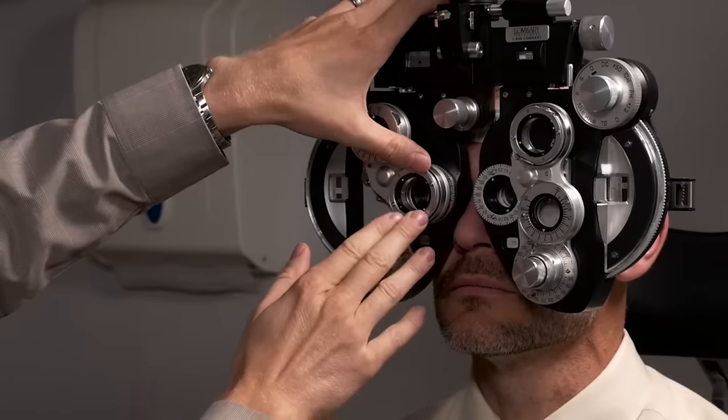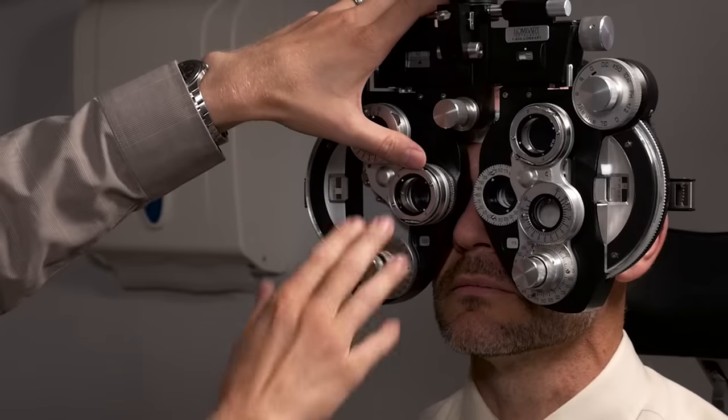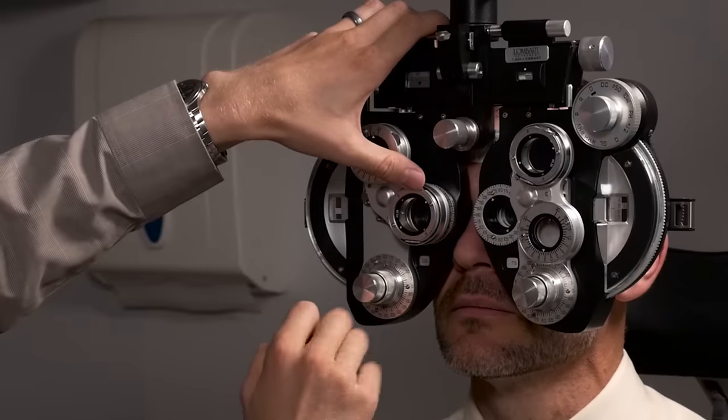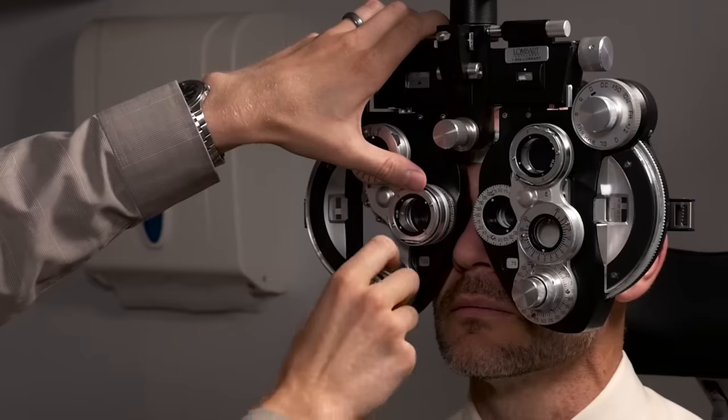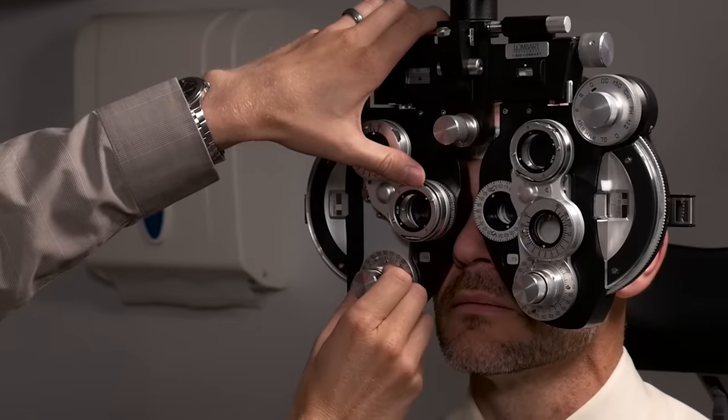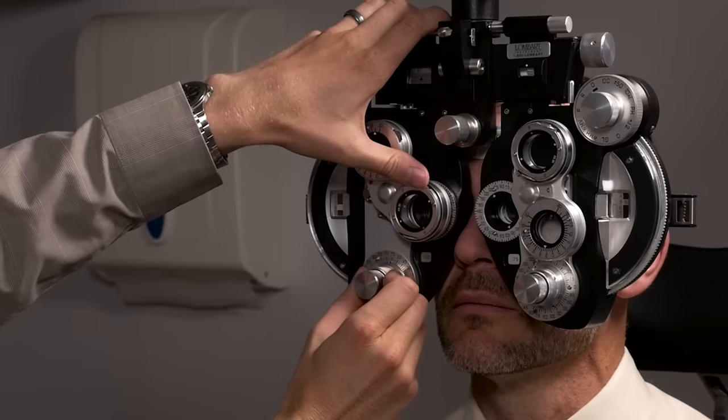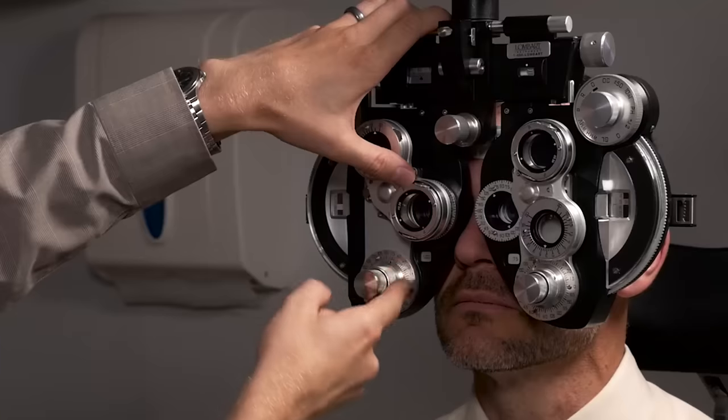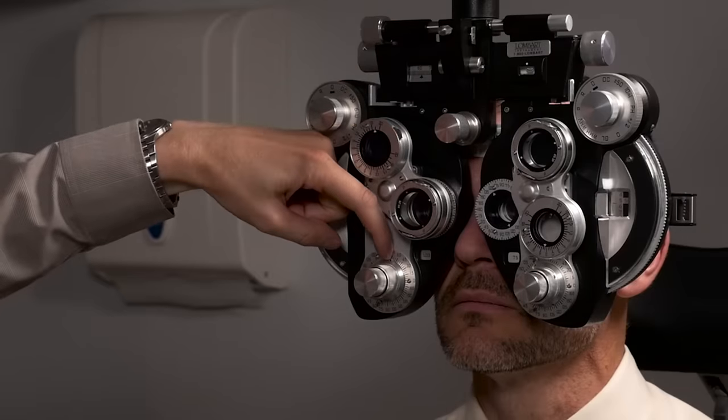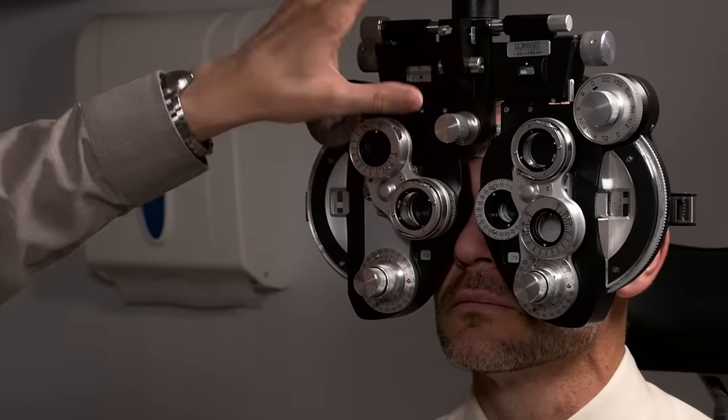In this case as I flip it I'm going to be asking him what looks more sharp and clear. I'm going to ask him what is more sharp and clear? Number one or number two? Number one. So in this case he said number one and for a plus cylinder phoropter which this is we turn the dial in the direction of the white dot here on the JCC. In his case because he said number one is better I turn the dial currently it's at about 85 degrees. I turn it to about 75 in this case. And then I ask him again. Let me kind of reiterate here that right now in the JCC the two dots are straddling this axis here. So right here on this axis refinement where all these numbers are 0 through 180 the line right now matches up at axis 75 and these two dots are on either side of that. So that's important in order to know to figure out where the axis of his prescription is.